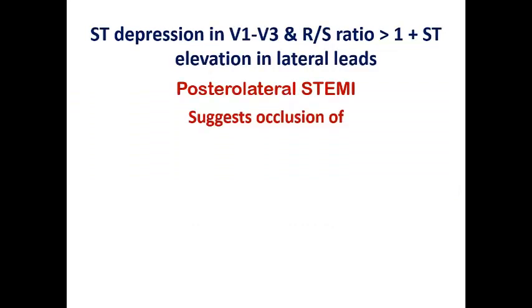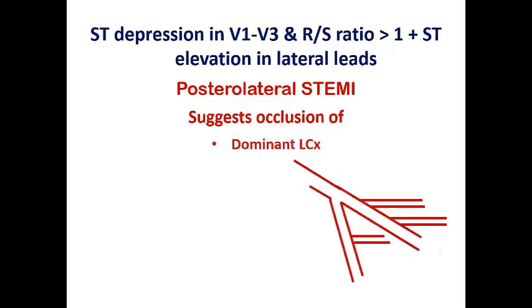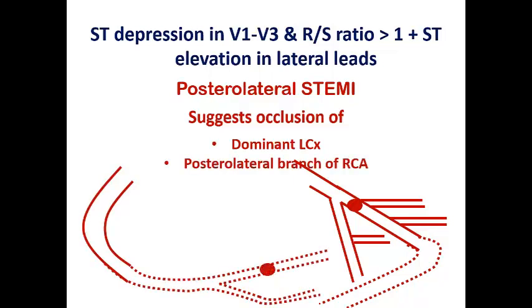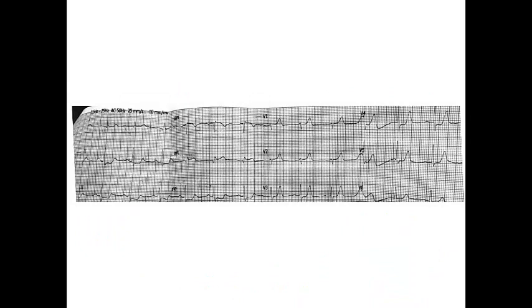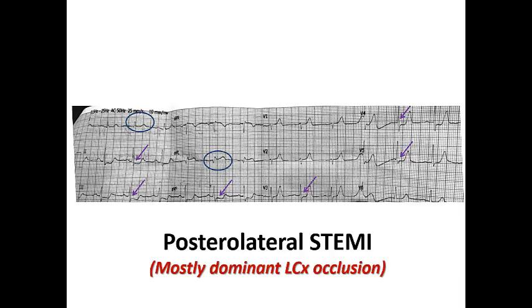When there are ECG changes of posterior STEMI with ST elevation in lateral leads, the first possibility is dominant LCX, since lateral wall involvement raises suspicion of LCX. However, it may also be the posterolateral branch of RCA, which by its name supplies both the posterior and lateral walls. In this ECG example, the patient has ST elevation in lead I and aVL with reciprocal depression in inferior leads — suggesting lateral STEMI — along with ST depression and RS ratio greater than one in V3, V4, and V5, indicating posterolateral STEMI.